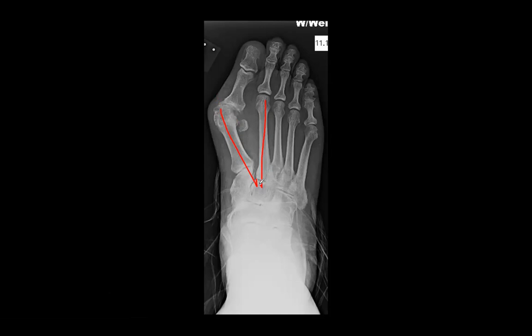Did you ask another question? Sorry, if you did, I didn't hear it. Sorry, what's the first and second IM angle? 0 to 8. Yeah, with this one, when you read different resources, they say 0 to 8. Some people say 0 to 12 because 9 could be normal. You know, it's odd when people talk about angles, where we say normal is this, but it's not abnormal until it gets up to a few degrees higher where there's like a little buffer zone. Right. So you can read sources from 0 to 8 up to 0 to 12.